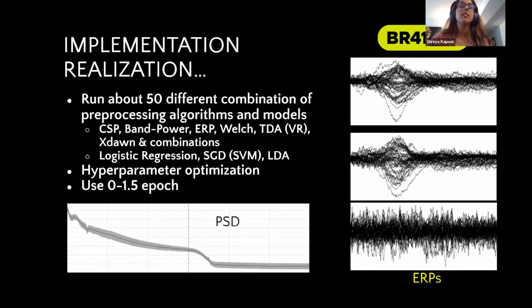When we were thinking about how to select these parameters and how to go about it, the best idea was to see the average effect. On the right-hand side, you can see the ERPs. We defined 3 classes for rock, paper, and scissors, and tried to see the evoked potentials for rock, paper, and scissors.